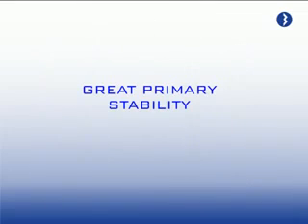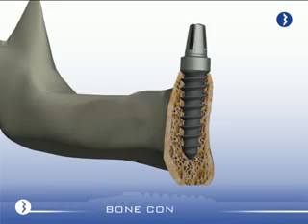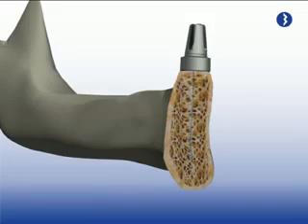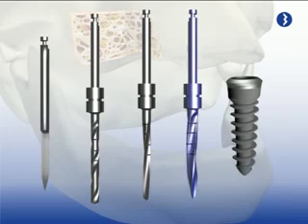To gain the best stability that characterises the Q-implant system and have the maximum benefit from the condensing and expanding properties of its coils, there are 2 things to keep in mind when drilling. In bones of lower osseous quality, spongy or type 4, we should avoid the last drill in the sequence we have stated.